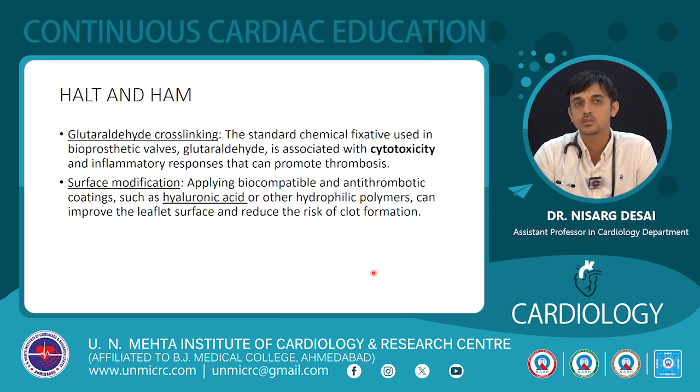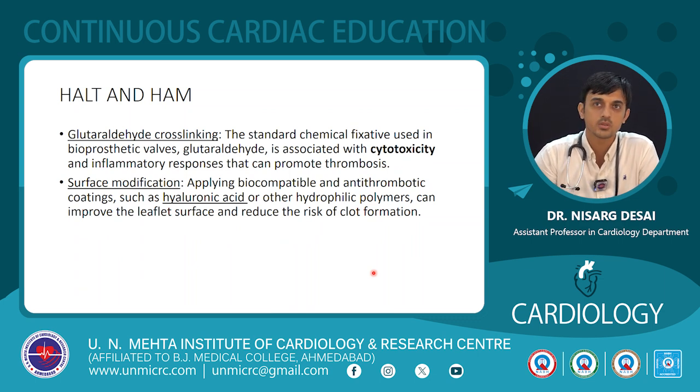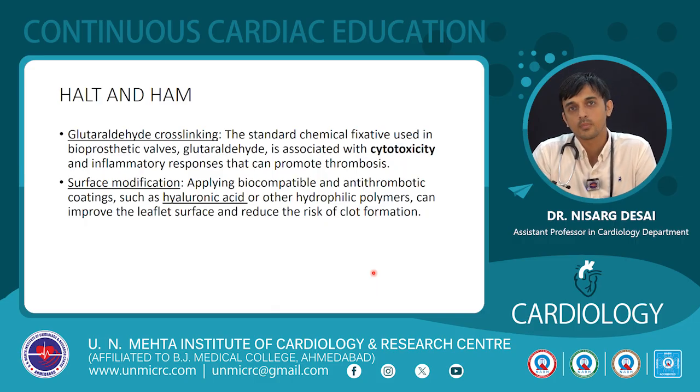Why there is HALT and HAM is because of the standard chemical fixative glutaraldehyde that was previously used, which used to cause cytotoxicity and inflammatory response at the site of implantation. So what we can do is use, instead of glutaraldehyde, biocompatible coatings like hyaluronic acid or other hydrophilic polymers that can improve the leaflet surface and reduce the risk of clot formation.